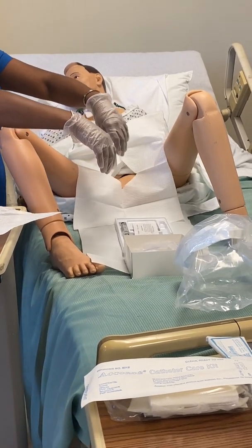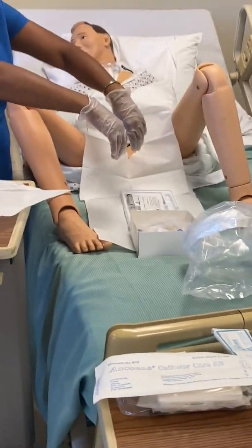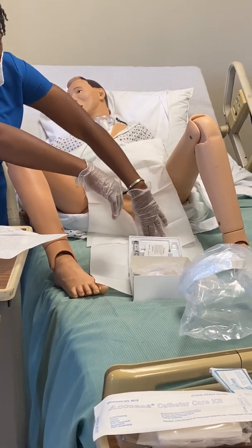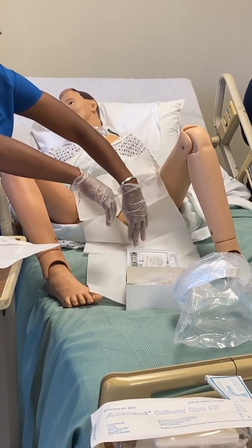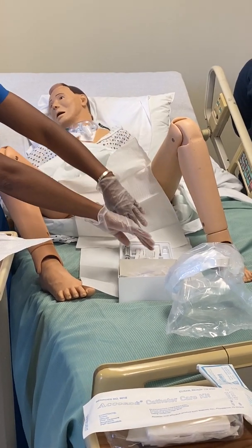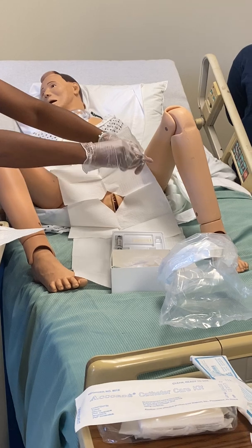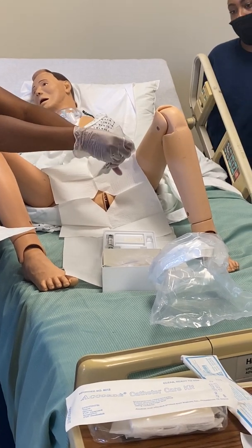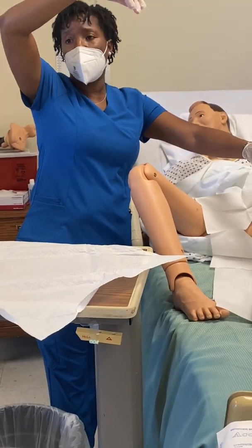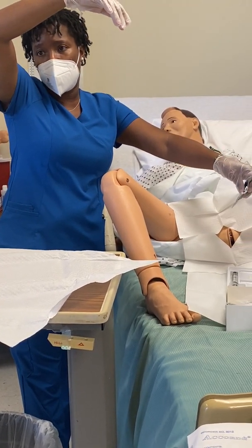All right? Now that I have this here, I'm not going to say I may not move this over. Because remember now, everything's sterile. Okay? So I have the option of touching everything. Okay, so I'm going to open these. And this is what I'm going to do. I'm going to come back around and drop. Okay? Remember, I can't go below my waist, so I got to just drop it.